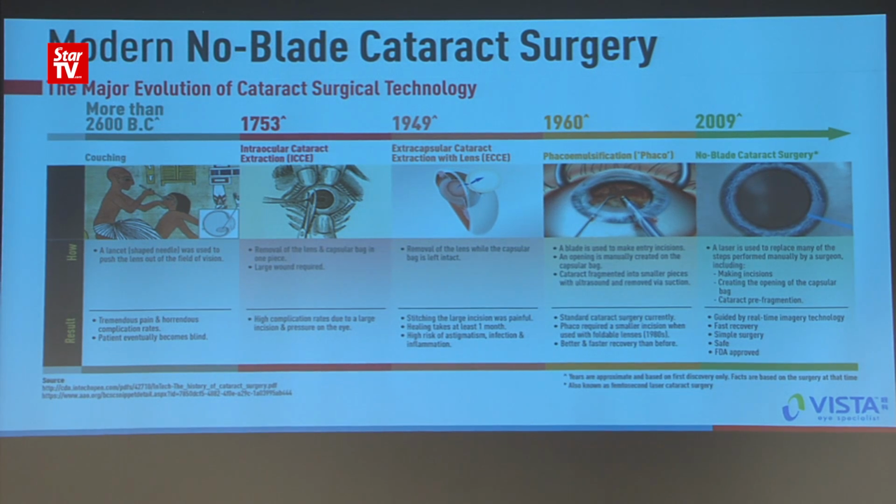So this procedure, phacoemulsification, is still being used in Malaysia today. Now what happens is that when doctors explain this procedure to patients, phacoemulsification is such a long word. Most doctors will just use the word laser, the magic word. It's easier, and patients seem to accept this word better. But really, no laser is involved in phacoemulsification. It is ultrasound energy.